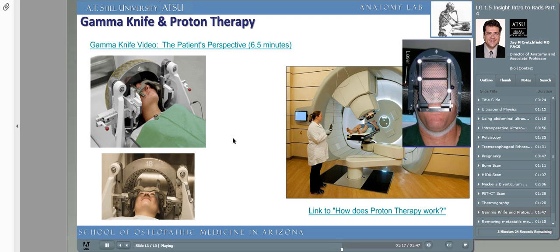The patient must have a special individually fitted headgear before treatment can begin. Because of the characteristics of proton therapy and the physics of proton movement in a magnetic field, it allows a beam of protons to enter at an exact depth without damaging surrounding tissues. Such is not necessarily true of gamma knife treatments, although over the years they have improved.